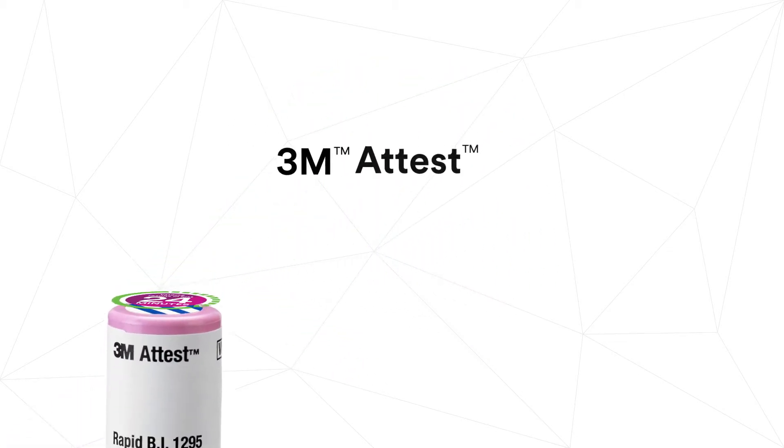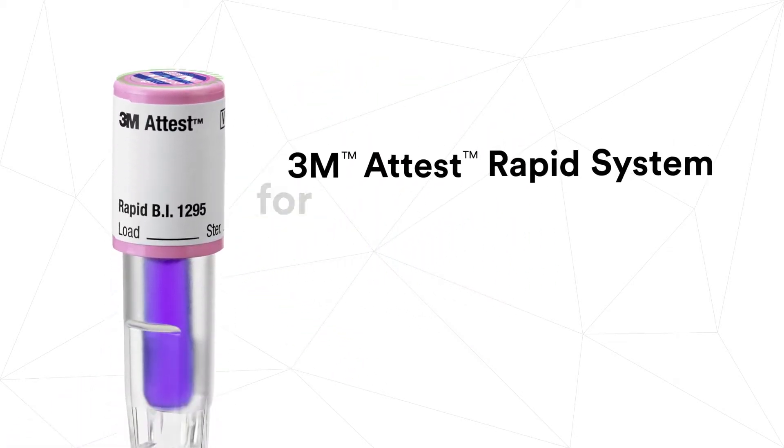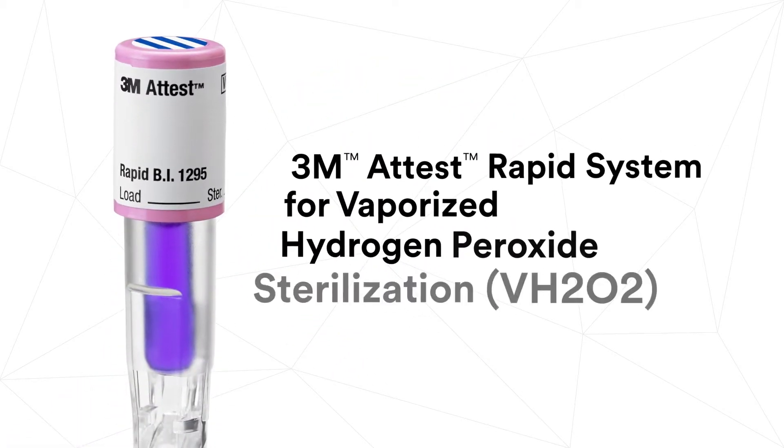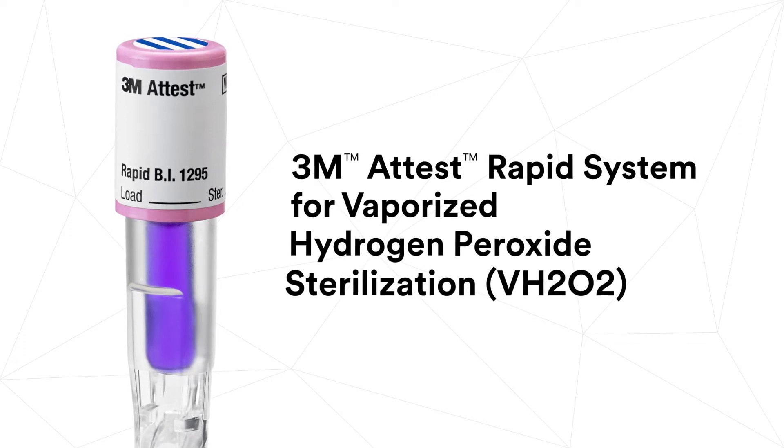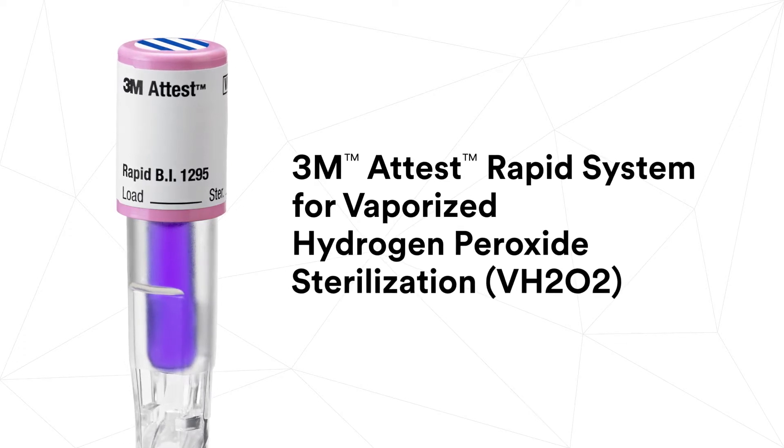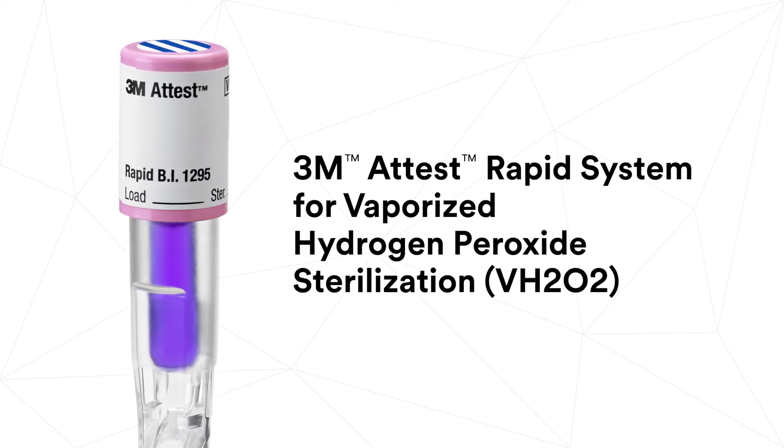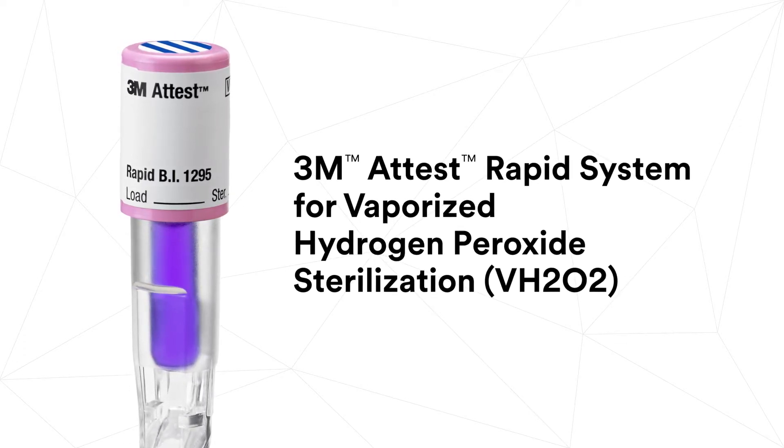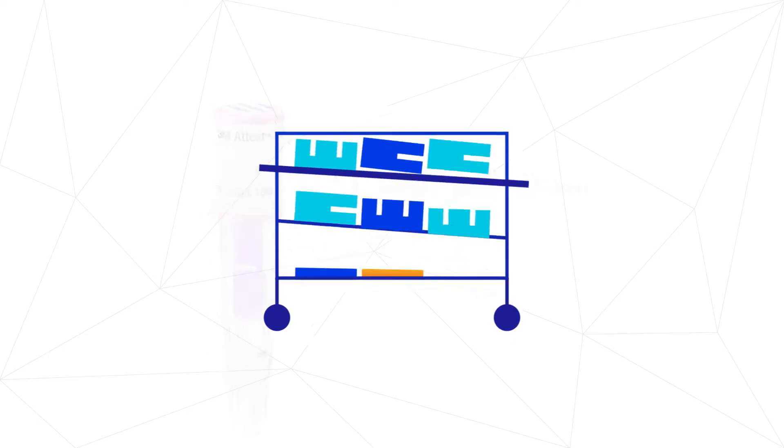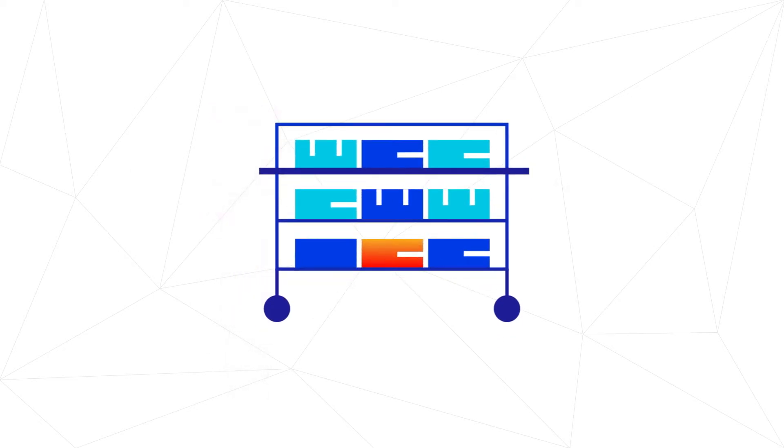With the 3M ATest Rapid System for Vaporized Hydrogen Peroxide Sterilization, you can get biological indicator results in less than half an hour.